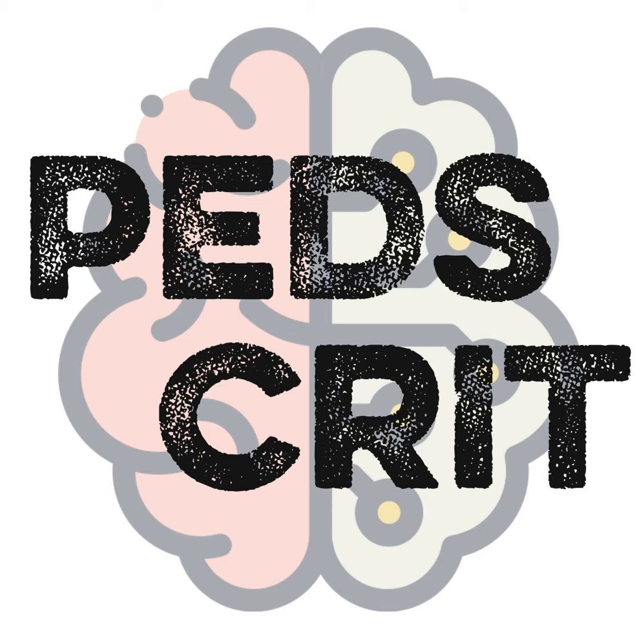Yeah. Is it fair to say that you're generally replacing or assisting cardiac output in VA-ECMO? And then because that's not definitive therapy, how are we using it in the care of this patient? Right. So as you very rightly said, Alice, it is a bridge. A VA-ECMO is a bridge. Yes, you are supporting primarily the heart, and sometimes the circulatory system. In terms of circulatory failure in sepsis, sometimes yes, there is sepsis-related myocardial dysfunction, but sometimes it's more the vasoplegia. But primarily, yes, you are supporting the heart.